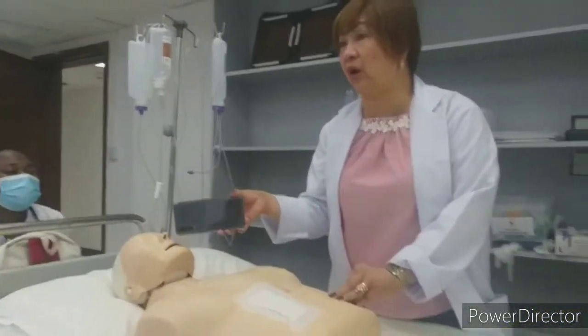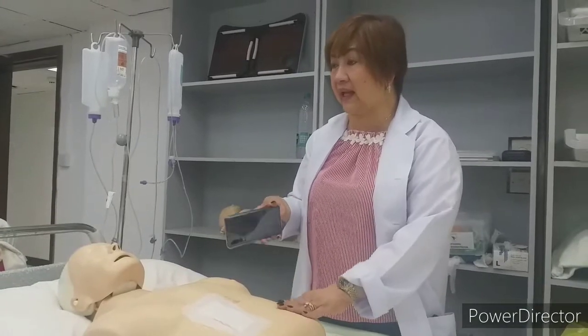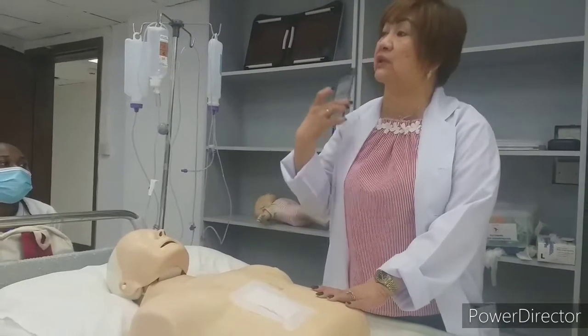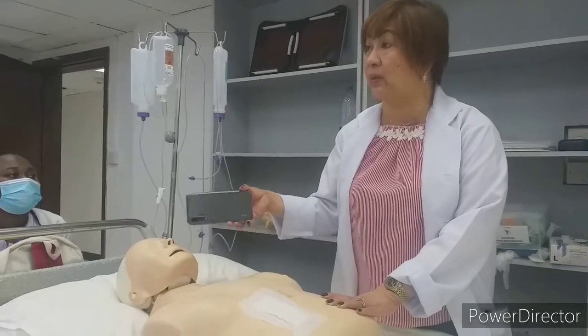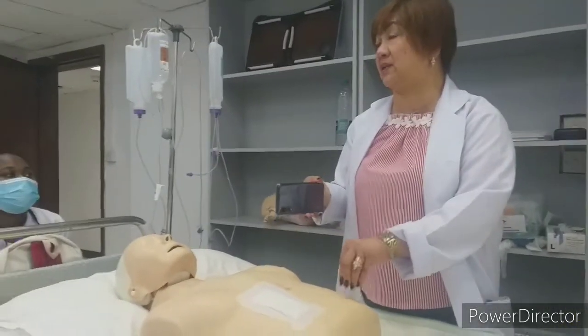Instead of giving your feeding by the NGT, you are giving by the peg. This peg is being given because the patient, though there is an NGT, continues to vomit. Not tolerating even with NGT. So the doctor will just advise the patient to have a peg tube.